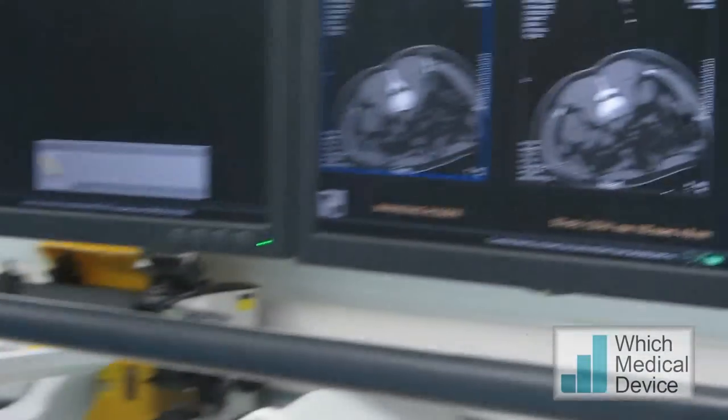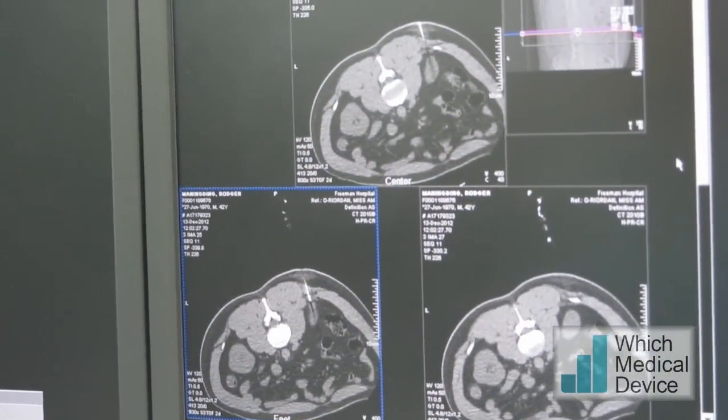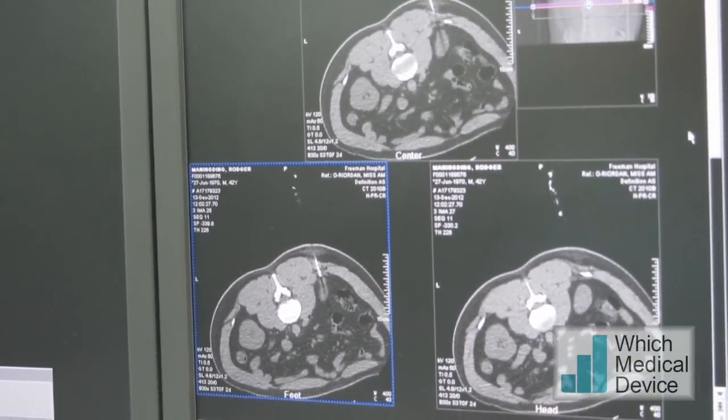We're virtually into the lesion, so we just need to go another centimetre or so and we'll be in it, providing we get the same level of inspiration.